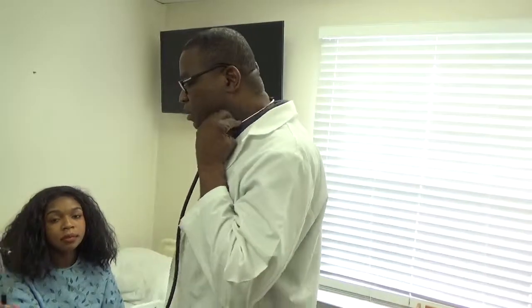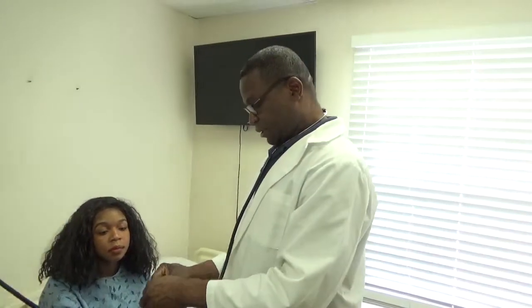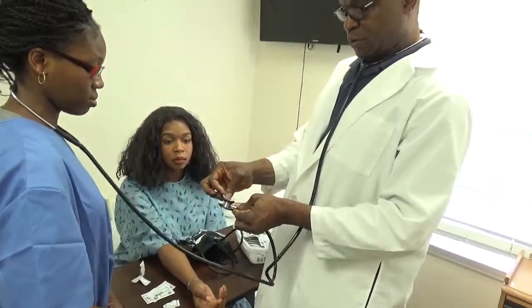Then you place the stethoscope around your neck. Make sure you place it the way it is going to go in the ear, pointing out. You should not place the stethoscope pointing inward into your ear — you will not hear it well; it should be pointing that way. Then you are going to wipe the bell of the stethoscope. You can use one wipe to wipe this one.